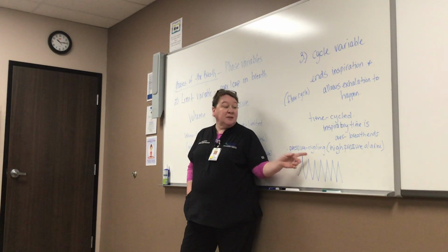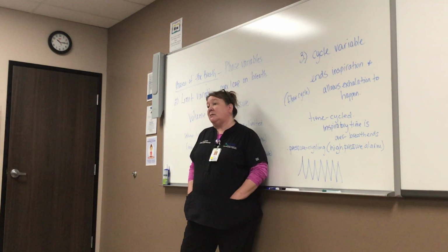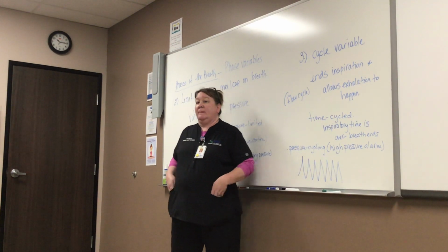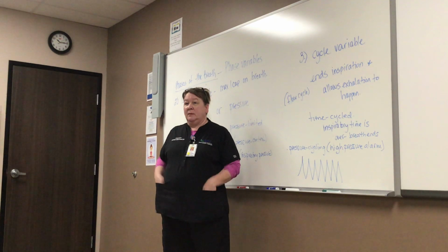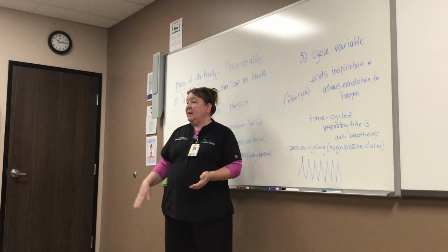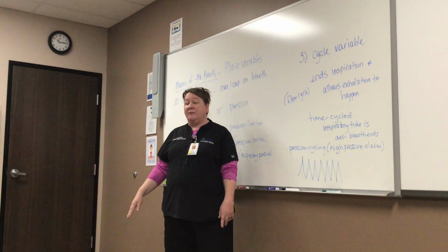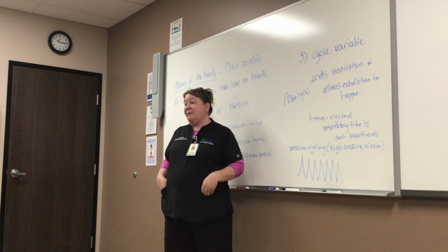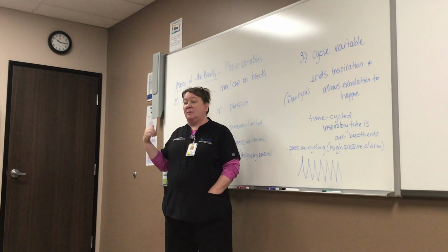So another way you'll sometimes see this is your ventilator is alarming and the high pressure alarm is being hit. What happens during that? Inspiration ends prematurely. It's a fancy way to say the breath stops. Up, stop, up, stop. Emergency, figure it out. Get them off the vent, try to bag them, see if they got a plug. If you bag them and you're not having any issues, you've got a blockage in the vent somewhere.